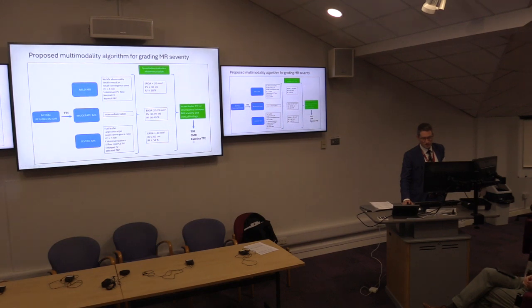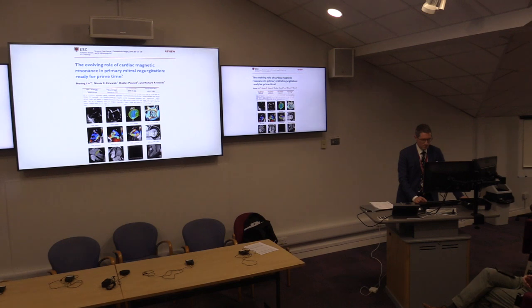So I occasionally use exercise transthoracic echo. If patients aren't breathless at rest but breathless on exertion, it makes sense to stress them, doesn't it? And see what's happening to the mitral valve. And there's some quite good exercise echo data. I'm not showing you that today, but Lancellotti's published a lot of nice papers looking at exercise-induced pulmonary hypertension in the setting of severe MR in patients who claim to be asymptomatic, and that's a license to intervene.